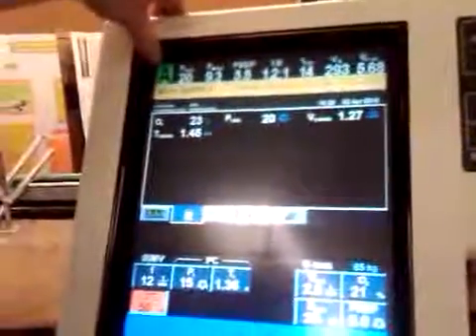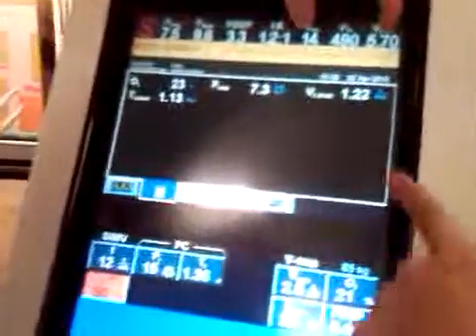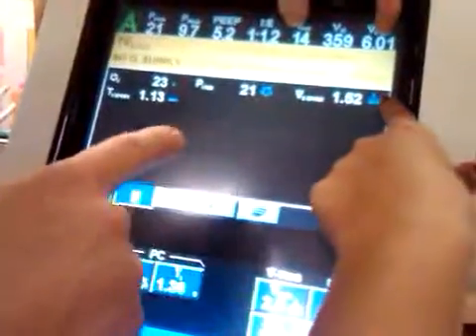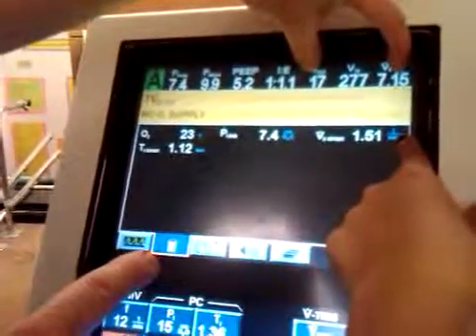Do it again. Okay, when it's S, do the breathing. Somebody does the breathing, please. When it's S for spontaneous, then you get these numbers, to get your parameters. All of these 3 numbers.